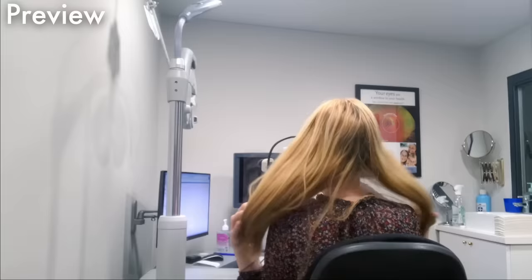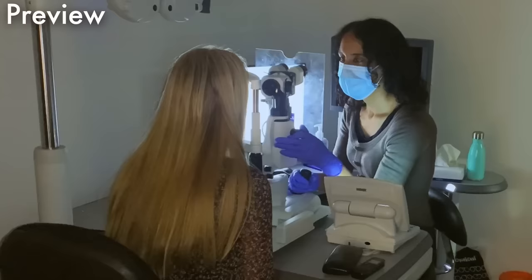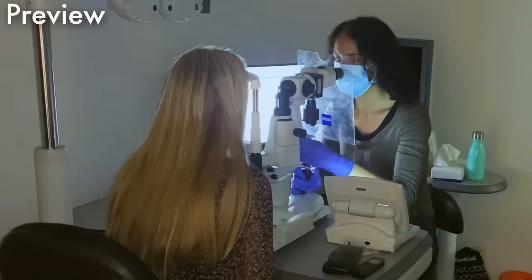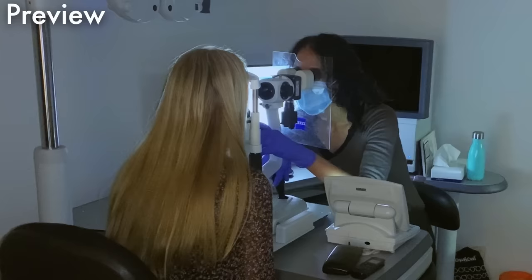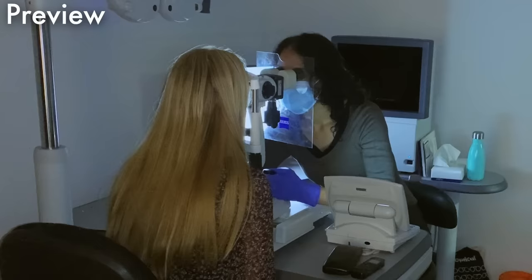Good, so chin on the chin rest, thank you, and forehead up in the bar. Good, is the height okay for you? Yeah. Great, so I'm just going to turn these lights down, okay? But you can stare straight ahead back at the screen behind me, it's fine. So first of all then we'll just check your pupil reaction. Good, excellent. Good, and if you can look down to the ground for me. Good. Good, lovely, look straight ahead once more.